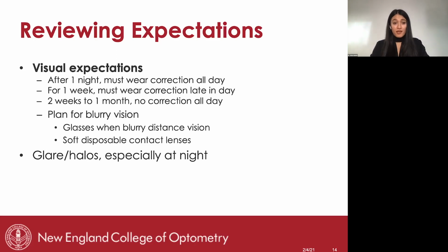So that's what we aim for, that at the 2-week mark, when they come back for their 2-week follow-up, I hope that the uncorrected visual acuity is right at target or where I want it to be. During the interim period when they're adjusting, they can wear their glasses, or we do daily soft lenses that they can use, in decreasing power as the days progress. For some older adults, that's what we've done in the interim to ensure that they're still corrected during the day when they're going through the process.